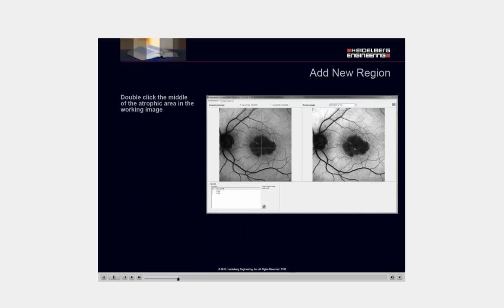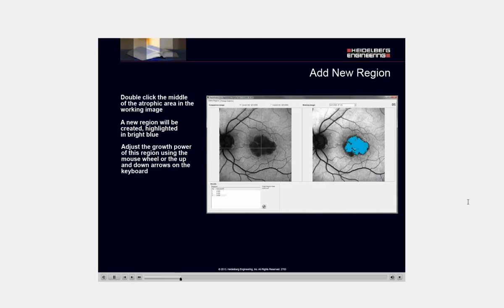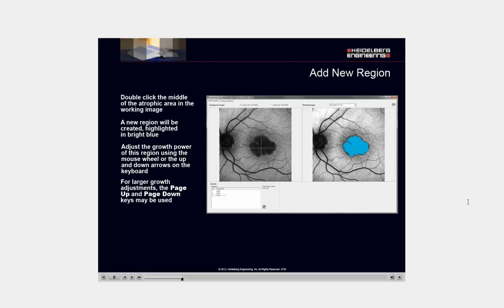Double-click the middle of the atrophic area of the working image. This will create a new region, highlighted in bright blue. Adjust the growth power using the mouse wheel or the up and down arrows on the keyboard. For larger adjustments, the page up and page down keys may be used.